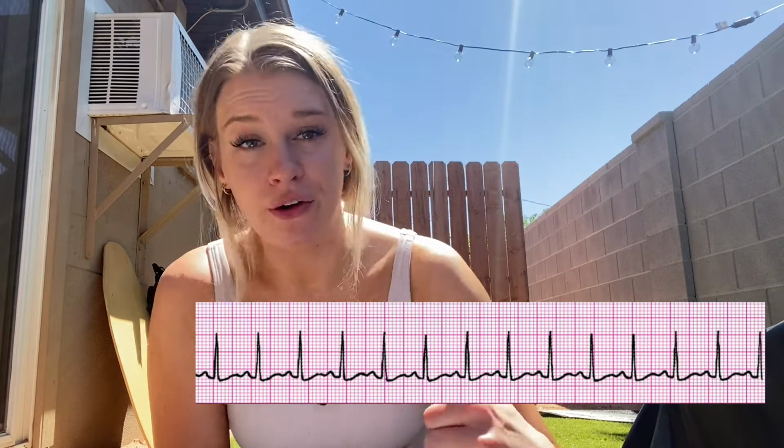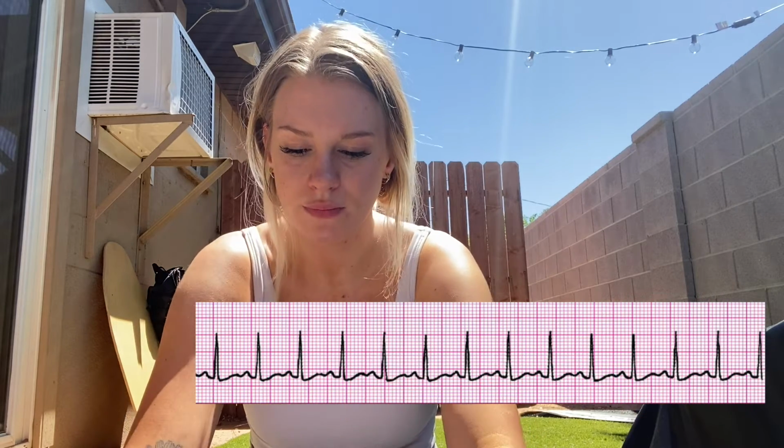Hypovolemia, which is low fluid volume in the blood, sepsis, anxiety, pain, exertion, and an upper OD. So like an upper overdose, basically like an Adderall overdose, that kind of thing. And look for P's on T's, because that is really dangerous. Look for P waves on T waves with sinus tach.